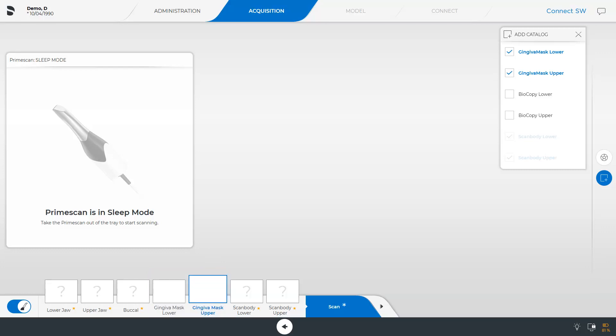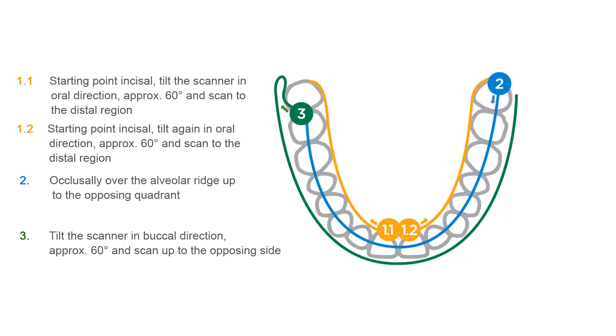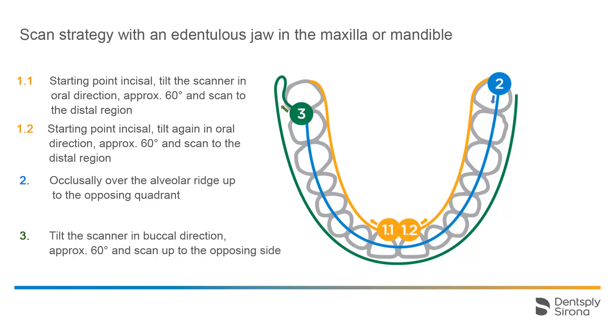These catalogs are optional image catalogs. Since this video is focused on the workflow, we skip the scan process of the individual catalogs. Nevertheless, we will briefly describe the corresponding scan strategy using a sketch. The starting point is incisal, and we tilt the scanner by approximately 60 degrees in oral direction.